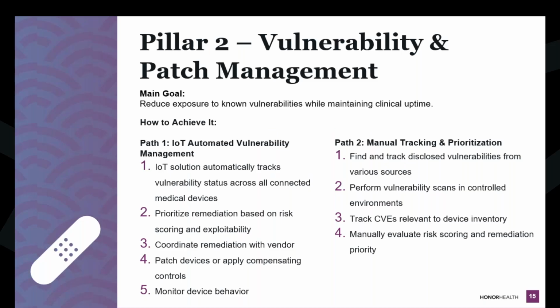Like I mentioned earlier, do you triage the medium vulnerability that's exploitable first, or do you work on the vulnerability that's a high risk but it's not exploitable? So just some things to keep in mind. And again, you coordinate that remediation effort and you patch the device or you apply a compensating control. If you're doing it manually, it's very difficult in a biomed setting to then monitor the device behavior because you're not networking, and in many cases not IT, and you don't have access to those same resources. So monitoring that device behavior is very difficult after the fact.